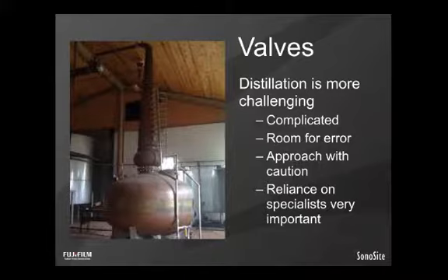Valves really define the boundary between the fundamental echo that every resuscitative doctor should know and advanced echocardiography, which is the realm of the cardiologist or an advanced trained echocardiographer from another discipline. And in general, when assessing valves, a more liberal threshold for escalating to expert advice and a humility regarding the room for error must be entertained.